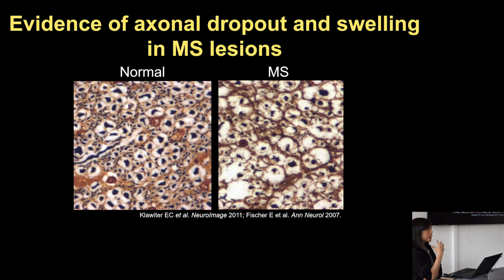And so this really highlights the need and the importance of having in vivo imaging biomarkers that get down to this histologic level, which is how we typically diagnose disease, to try to bridge this gap and really bring it in vivo so that we could observe how the disease is affecting people at different stages of their disease course.